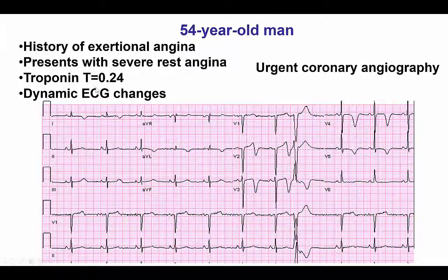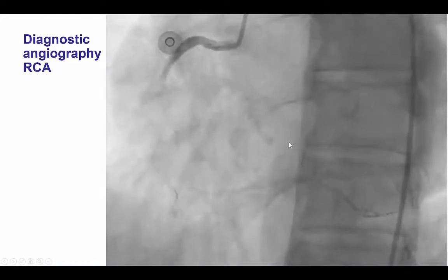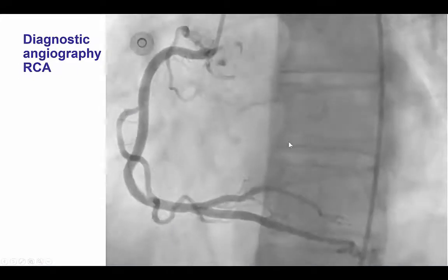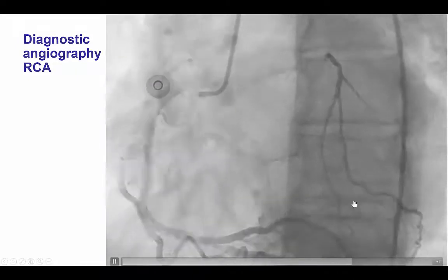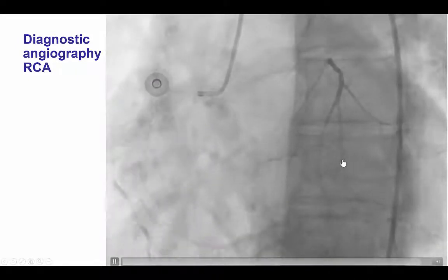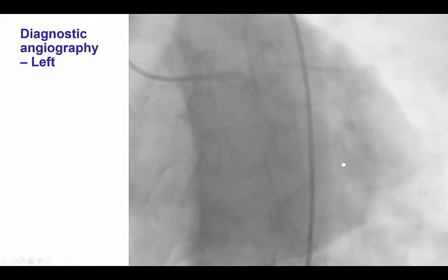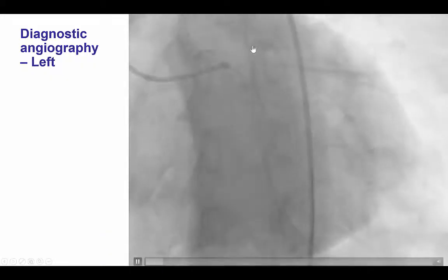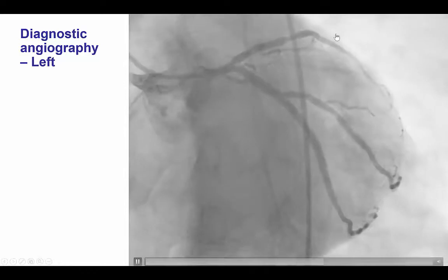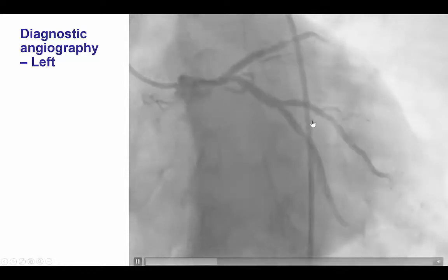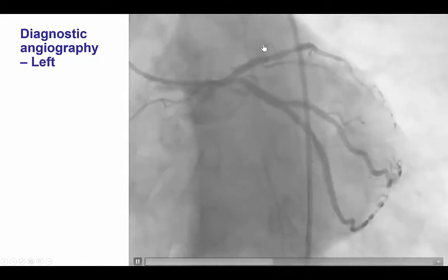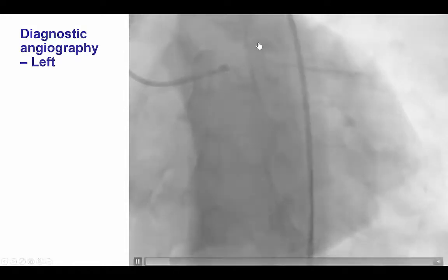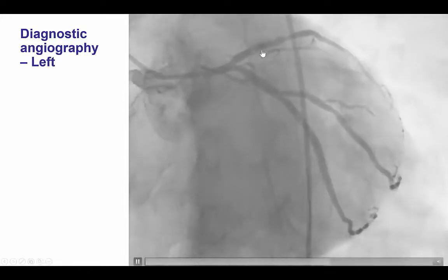The patient came with non-ST elevation myocardial infarction and some non-specific EKG changes. Diagnostic angiography showed a patent right coronary artery that was supplying the LAD through two epicardial collaterals. There was an occlusion of the mid-LAD at the takeoff of a large first diagonal branch, and there was no significant disease in the circumflex branch. Therefore, we had a LAD CTO with a blunt proximal cap at the site of a bifurcation.